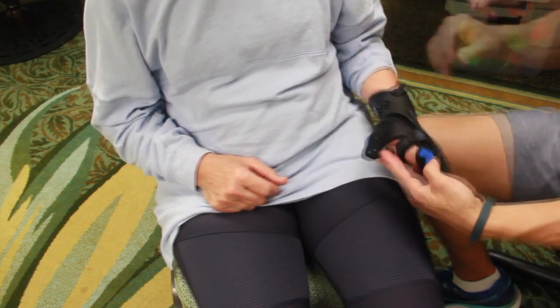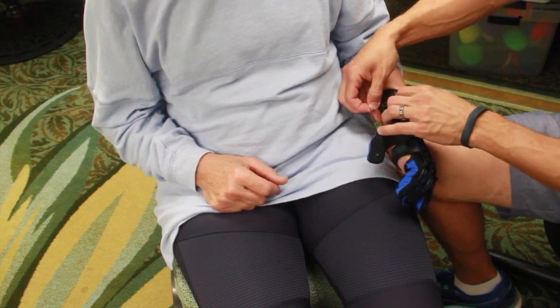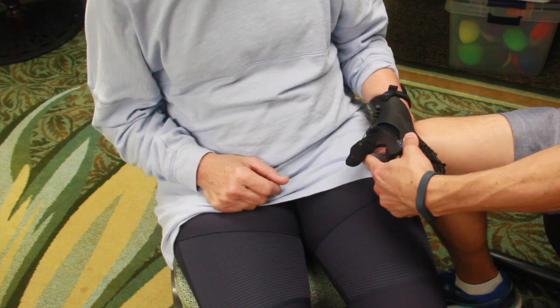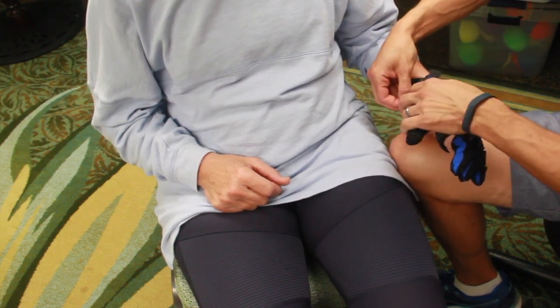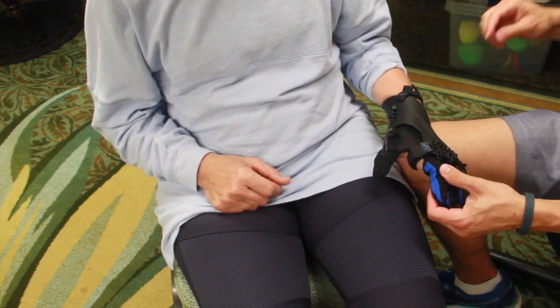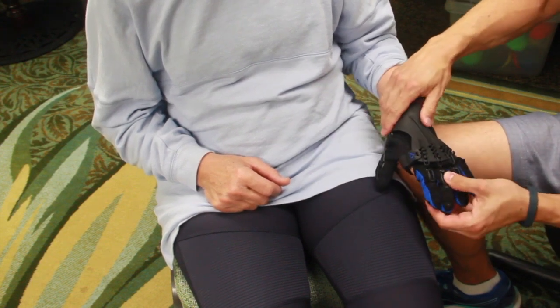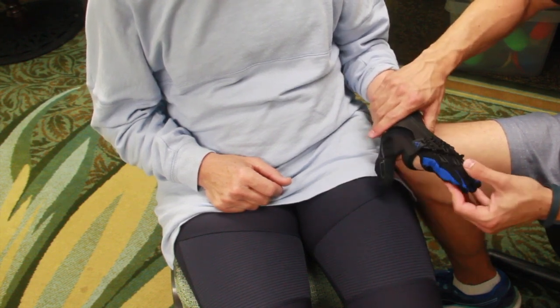Next, we're going to put some tensioners on the thumb. You can add multiple thumb tensioners. It's not just for one. So I'm adding 1 tensioner, and then I'm going to add a second tensioner. So you can connect it to the same hook and then pull back and reapply it to another portion of the forearm shell. And now I have the tensioners at the thumb, as well as the small joint at the thumb, which is called the IP joint, and I have tensioners on the fingers as well.